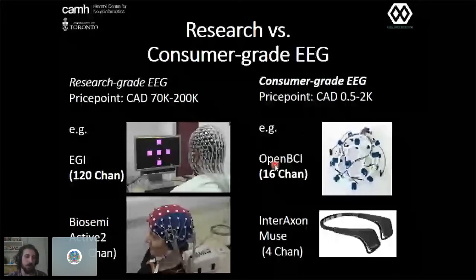The use case companies are aiming for in a consumer grade, or mass market, context is people with less patience, less technical chops to deal with, and less time. So for all those reasons, there are a lot of technological innovations that are often featured in these technologies, and just the fact that they're newer sometimes also helps.